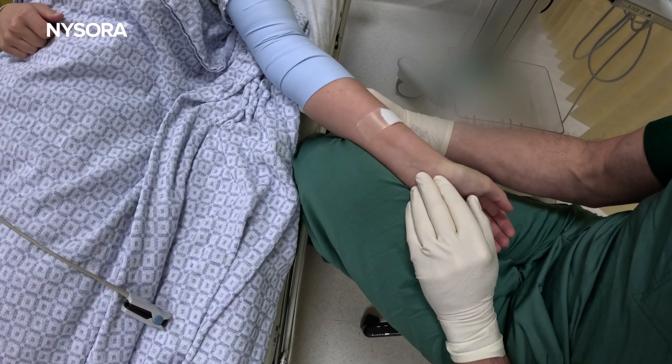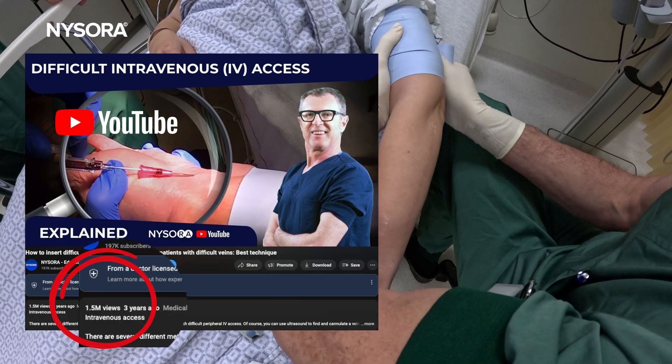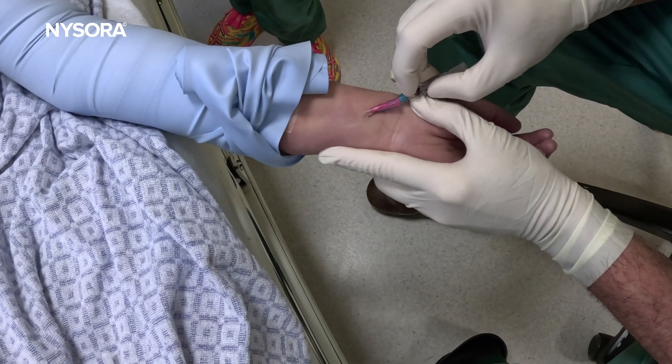In this particular patient, as you will see, there are no visible veins, and we have applied certain techniques and strategies in order to engorge the veins. However, the initial attempt was unsuccessful. So just as I am teaching how to, I actually failed. See how I failed, why I failed, and what I did to correct that failure.